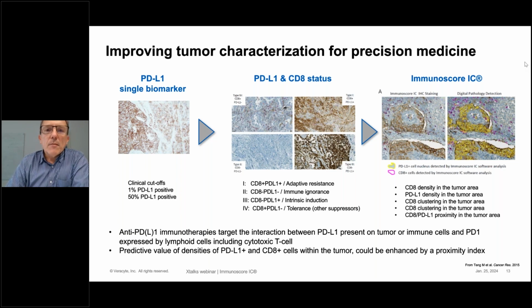Today, the main marker is PDL1, detected by immunohistochemistry and analyzed through various methods like the tumor positive score or TPS and CPS, but basically the idea is to quantify visually the expression of PDL1 by tumor cells or immune cells.